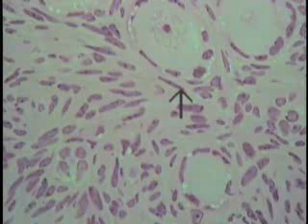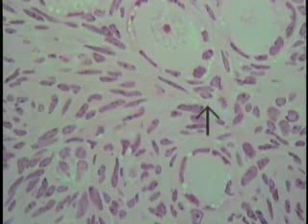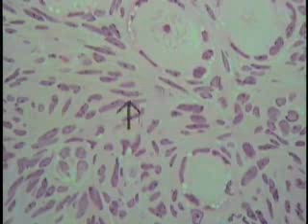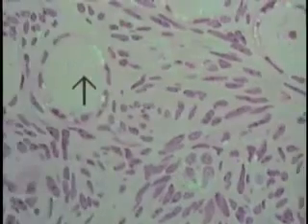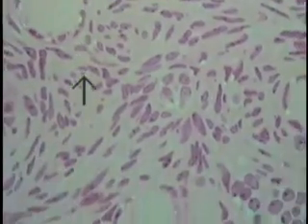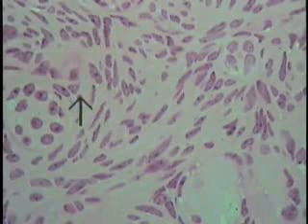The cytoplasmic extent cannot be determined visually, and one assumes that this nucleus belongs to a spindle-shaped cell, and its cytoplasmic boundaries probably extend from here out to here, as are all these, as indicated by the pointer, cut at different angles. So these are some of the problems that are encountered when examining a tissue under the microscope.